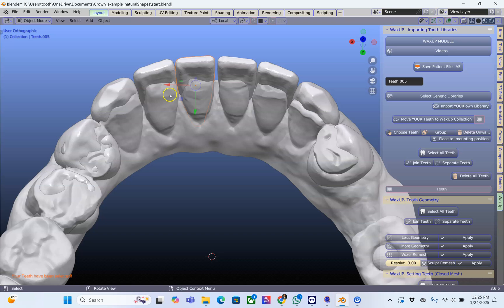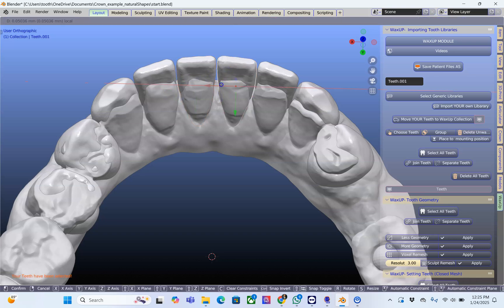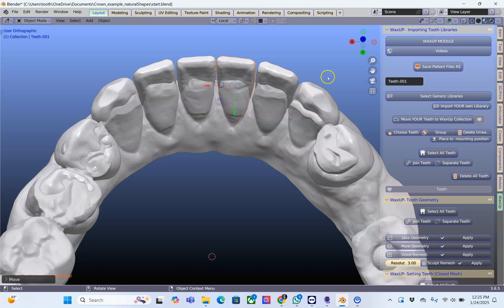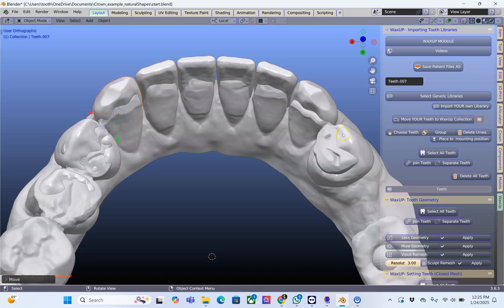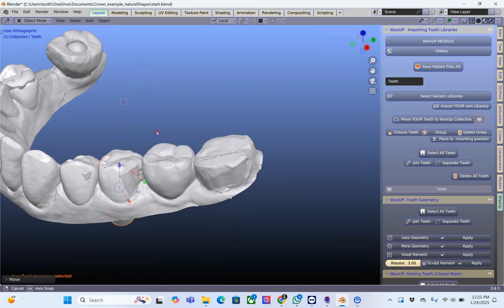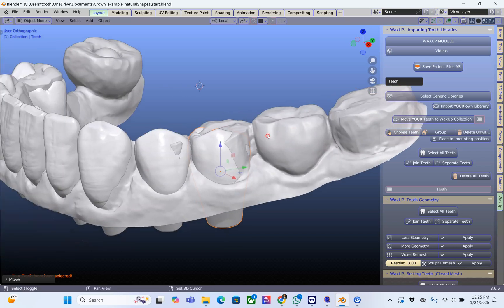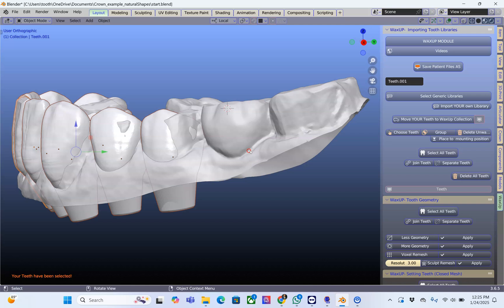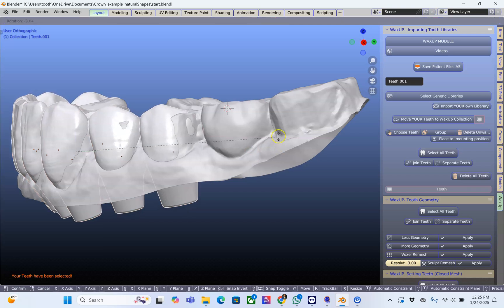This is not always the case though. I'll just close up the diastema over here and over here as well, and move this tooth forward. I'm going to look at it from the side and shift all of the teeth — select all — and we may need to rotate them a little bit as well.